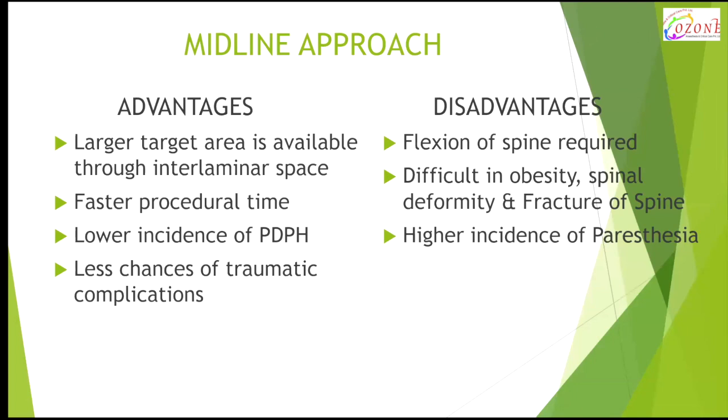So what are the advantages and disadvantages of the midline approach? Advantages are that in the midline approach we get a larger target area to the interlaminar space. There's a faster procedural time. There's a lower incidence of post-dural puncture headache and fewer chances of traumatic complications.